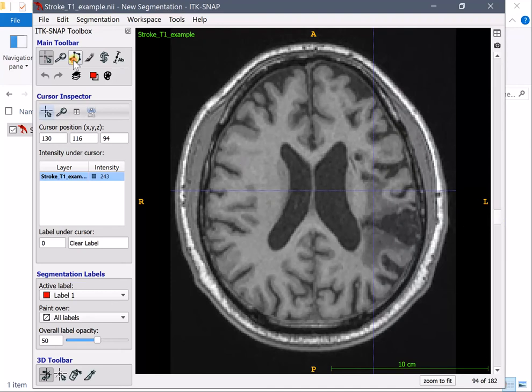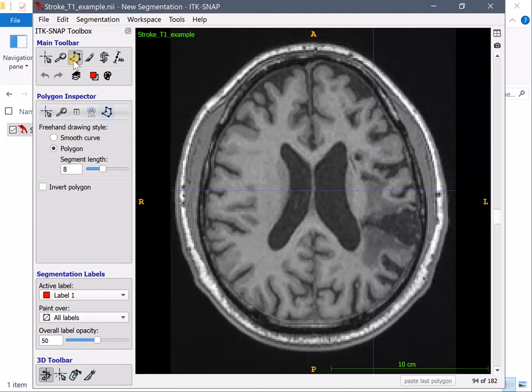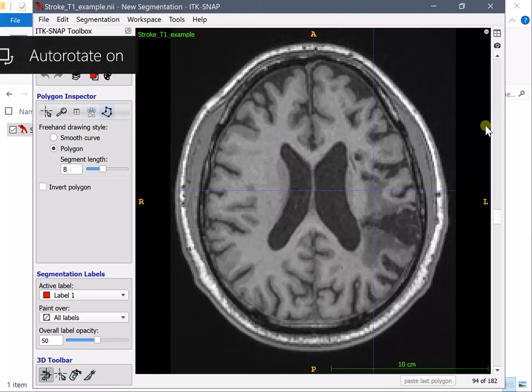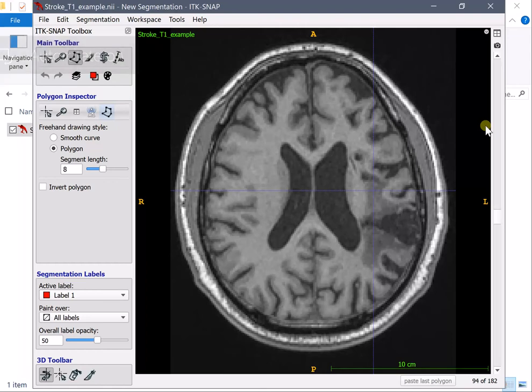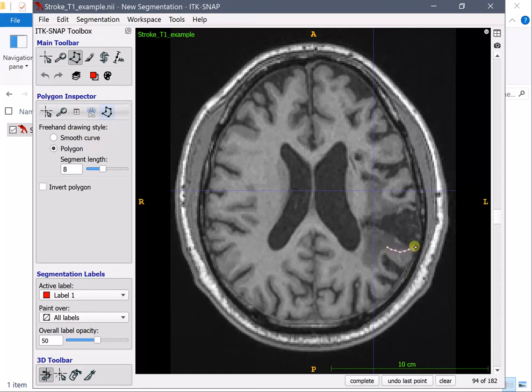You go in polygon mode and from this moment on you can simply use your pencil or your mouse cursor if you're using a desktop to start to draw the boundaries of what you think is the lesion and that's what I'm doing now.